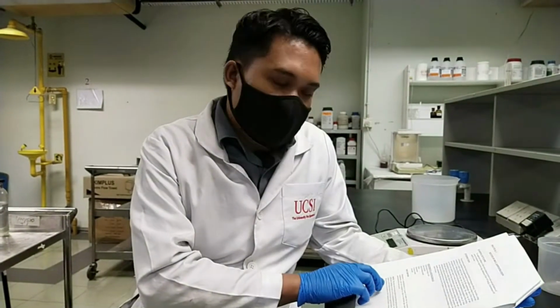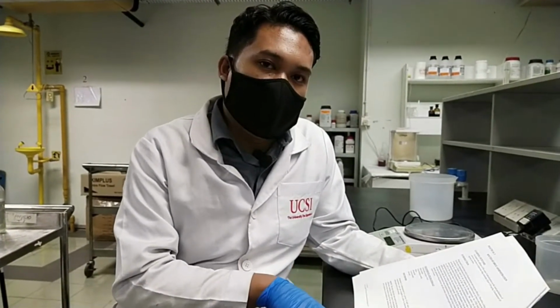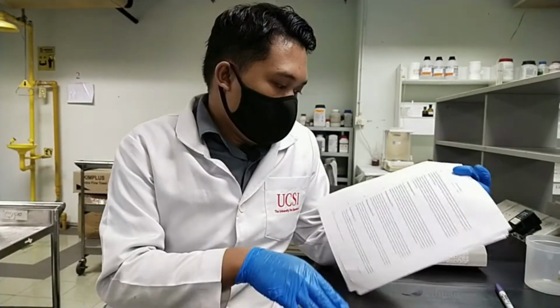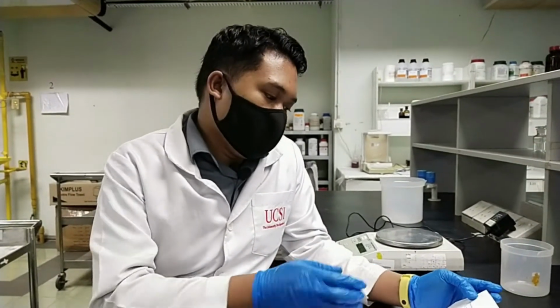And we're going to use ketamine as our drug for today. After the injection of the drugs, we're going to monitor the mice for a few minutes and record the duration of the drug effects. So without any further ado, we're going to show you how to take the weight of the mice by using the pen balance here.